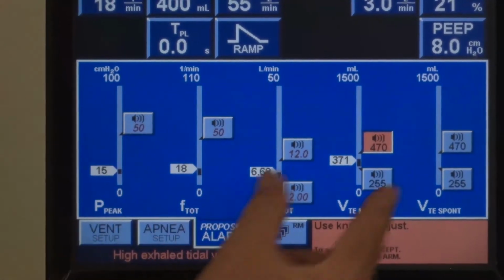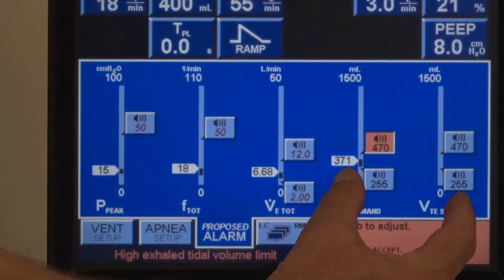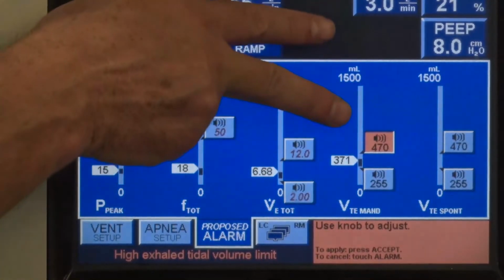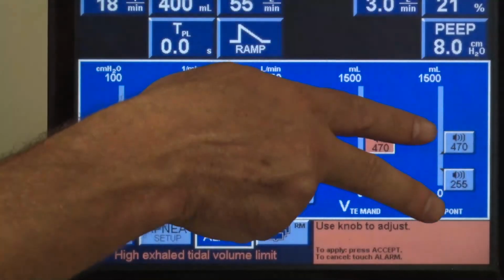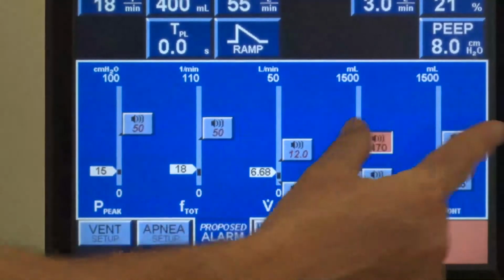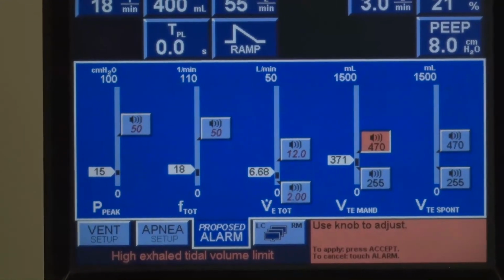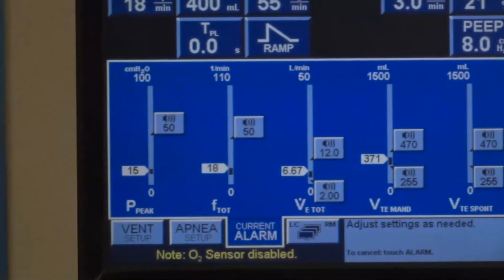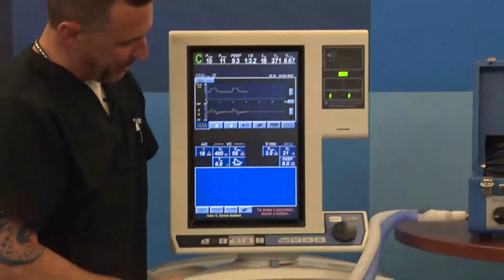Why did we do that? Think of the mode SIMV. In SIMV, you might be delivering mandatory breaths that are slightly larger, and during the SIMV, you might be using pressure support. Those breaths could be a little smaller. So we allow you to bracket them separately. Press accept and confirm the whole darn batch. Move efficiently, move quickly. Go ahead and close that page down.